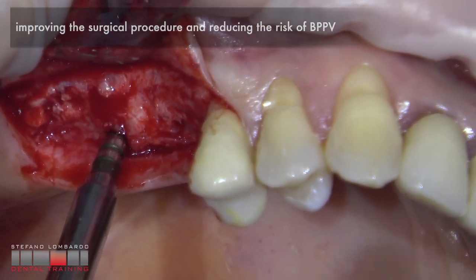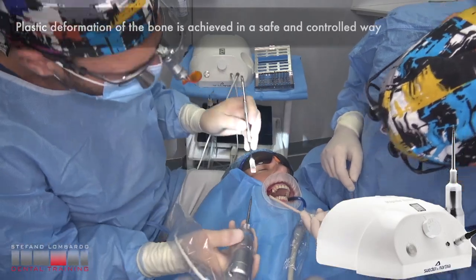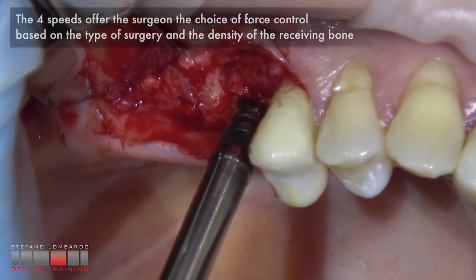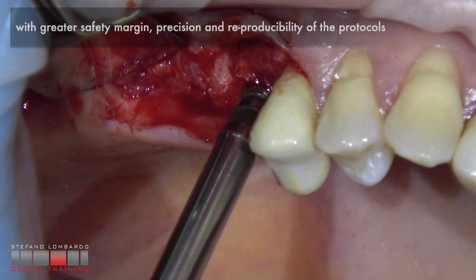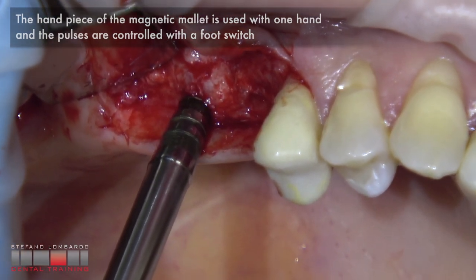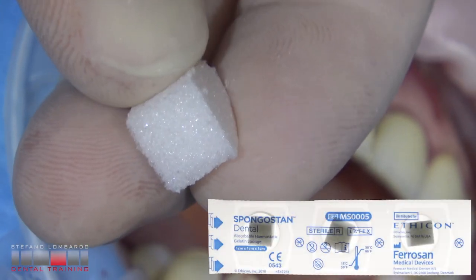Compared to the manual mallet, the magnetic mallet has better control of the force transmitted to the bone, improving surgical procedures and reducing the risk of BPPV. The magnetic mallet delivers a high-intensity electromagnetic impact applied in a very short time. Plastic deformation of the bone is achieved in a safe and controlled way. The force settings offer the surgeon a choice of force control based on the type of surgery and the density of the receiving bone, with greater safety margin, greater precision, and greater reproducibility of the protocols.